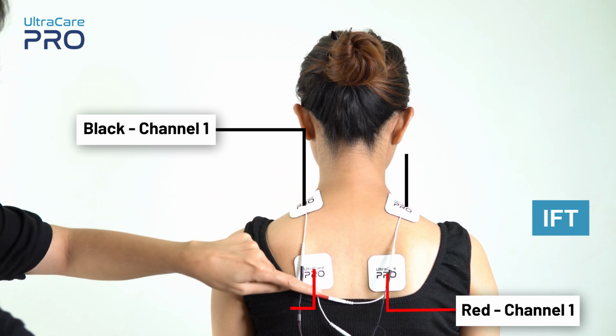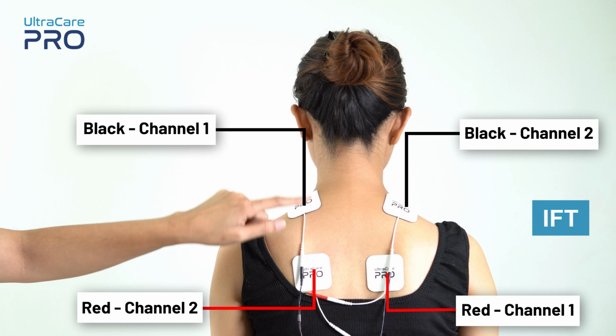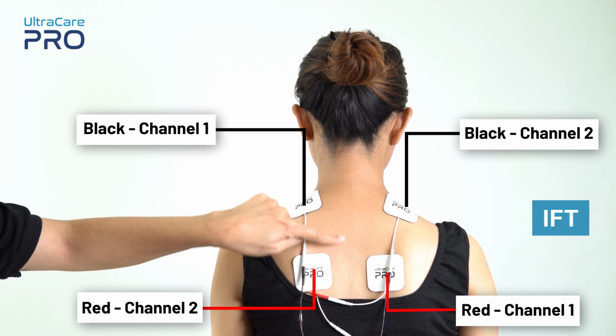For IFT application, the black and red electrode from channel 1 is placed diagonally opposite to each other. Similarly, red and black electrode from channel 2 is placed diagonally opposite to each other in a way that they cross each other, so that the area that is painful gets covered.